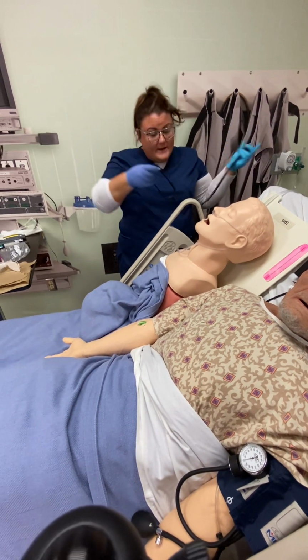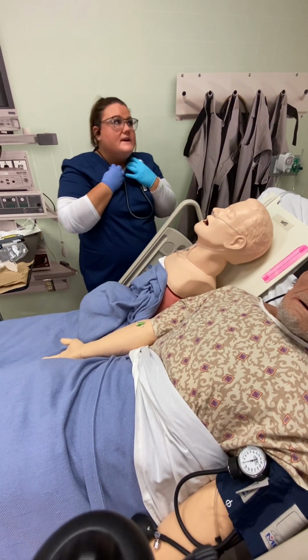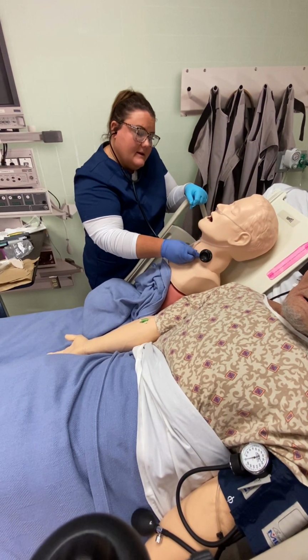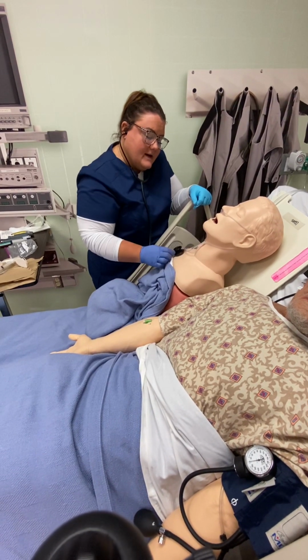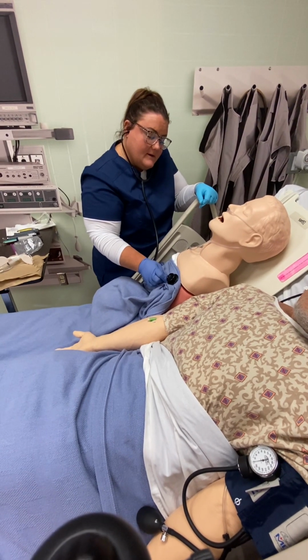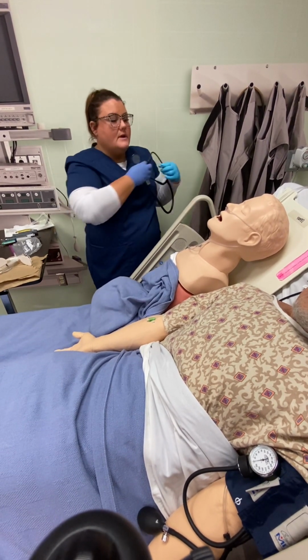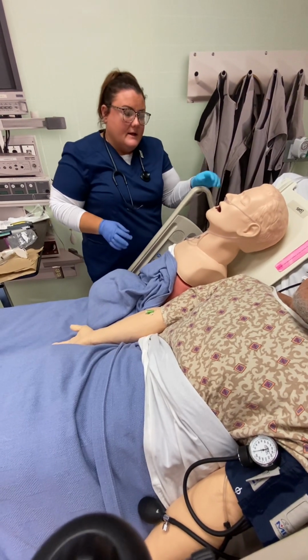So I'm gonna go ahead and just reassess him. I'm looking at his heart rate, his respiration rate, his blood pressure, SpO2. I'm gonna listen to him again. Can you tell me your name? Okay, great job. I'm gonna listen to him one more time. Make sure that he sounds all clear and that he didn't aspirate anything. Great job.